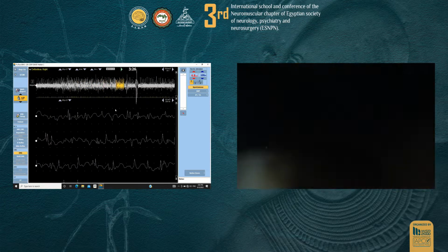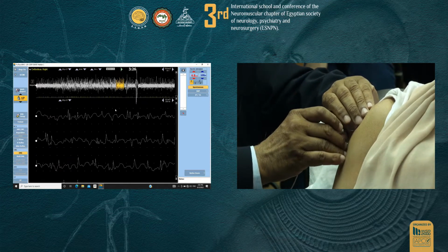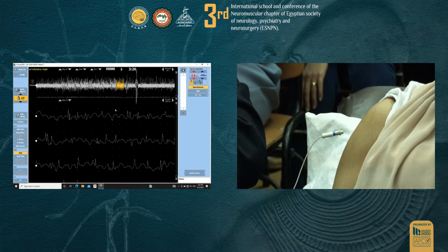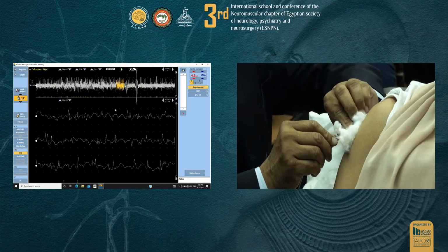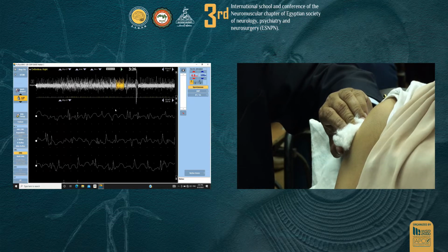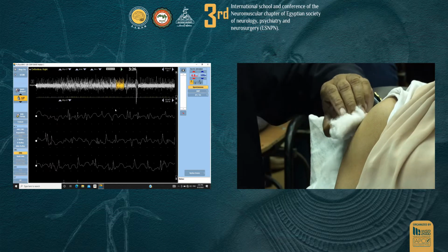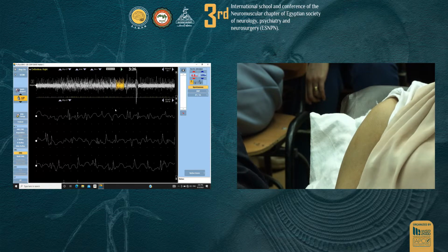Let me just put my phone away. Put phone away, huh? Yes, we can try that. Sorry. And a ground. Since you're going there, you got another ground. Let's do both. Yeah, yesterday we had a very good signal in this, but that was another room. Sorry, this was not the room. So maybe it's the room.